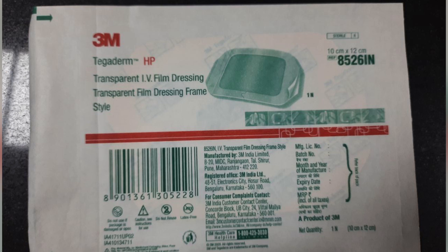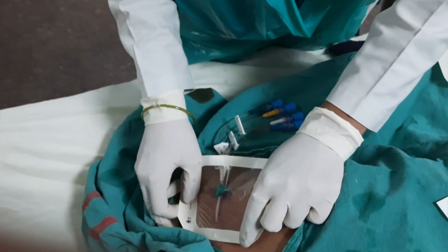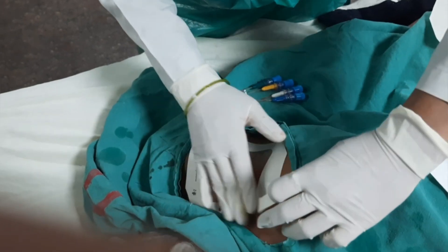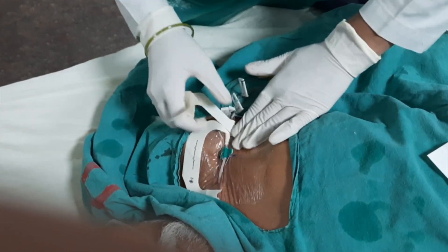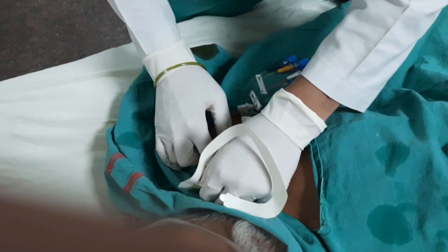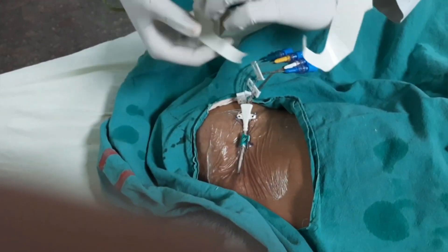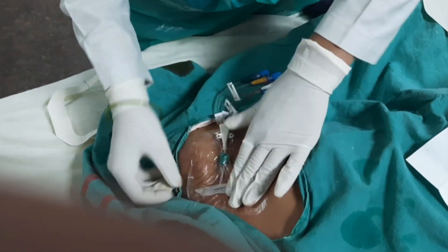There is a ready-made plaster available in the market called Tegaderm. We will stick this Tegaderm to our central line. Remove the outer ring of the paper to stick the Tegaderm to the skin. It has a small piece of paper on which we can write the date of central line insertion.